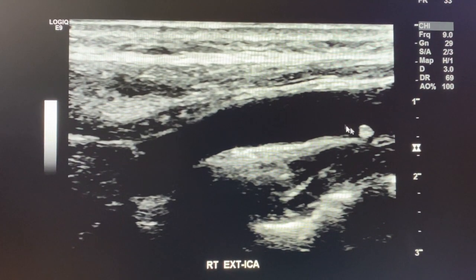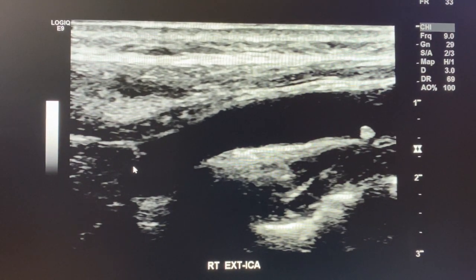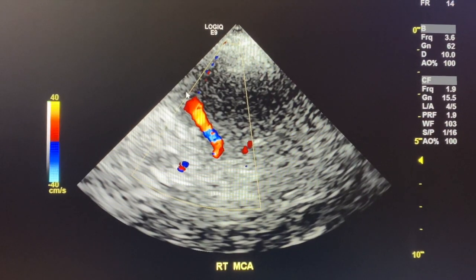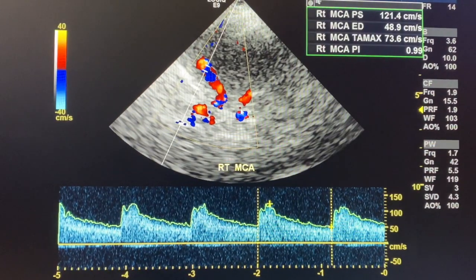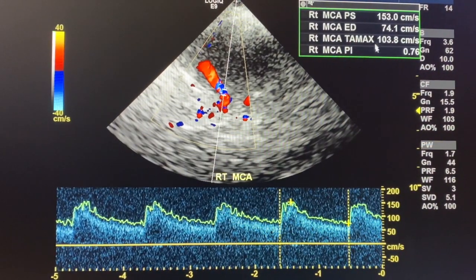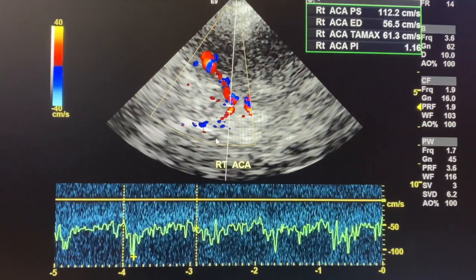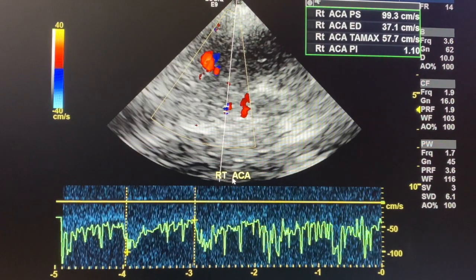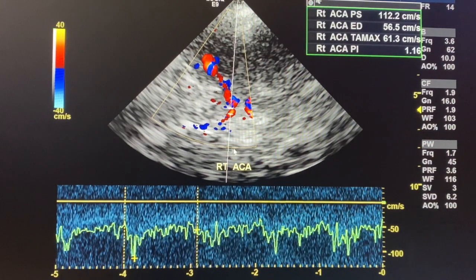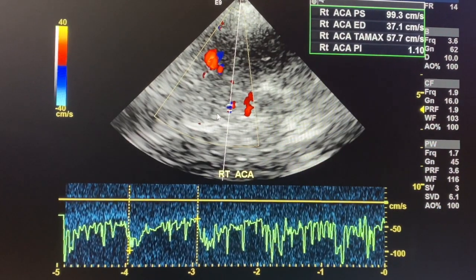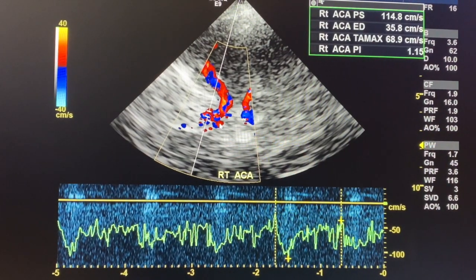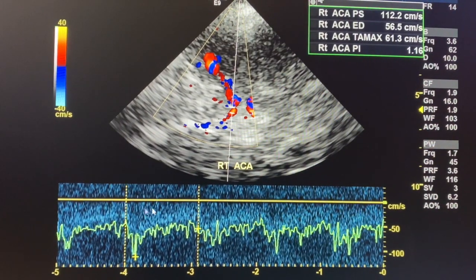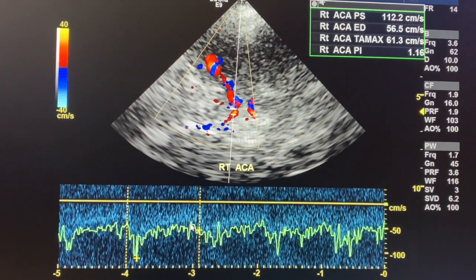Now the right side — there's a little plaque visible over there. Right ICA with color Doppler, then right MCA. Same thing: survey the vessel, find the highest velocity. On this side it's 103, and for the right ACA it's 69. The ACA is very difficult to find on a lot of patients — it's a very small vessel and really challenging to get.